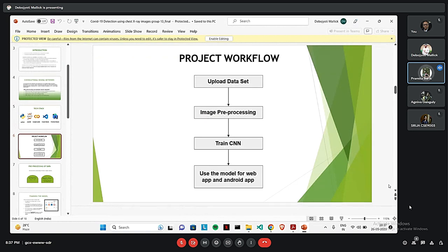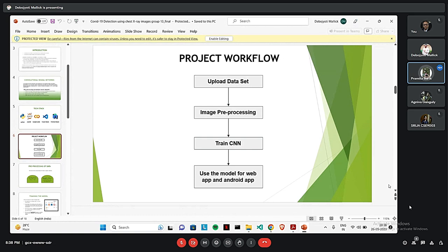Here is our project workflow. At first, we will upload the dataset on Jupyter and pre-process the image. Then we will use the pre-processed dataset to train the model. Then we will use the model to make the web app and the Android app.